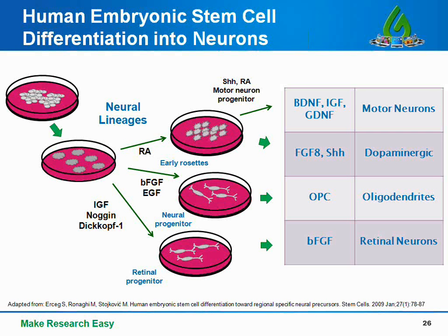absence of FGF-basic while in the presence of insulin, transferrin, selenium chloride, and fibronectin to promote differentiation into neural progenitors, which were then cultured in basic fibroblast growth factor, promoting differentiation into neural precursors.